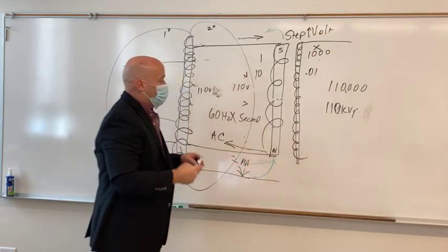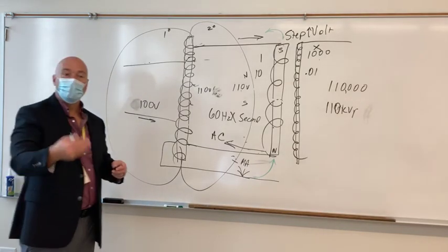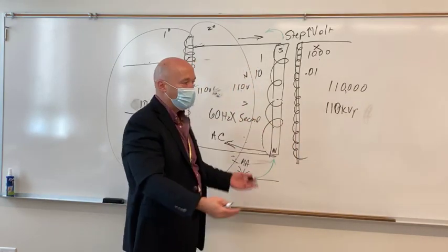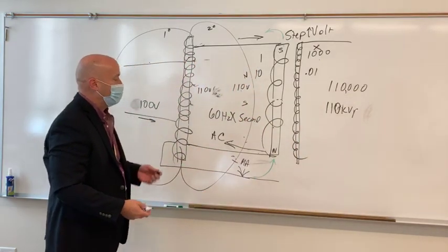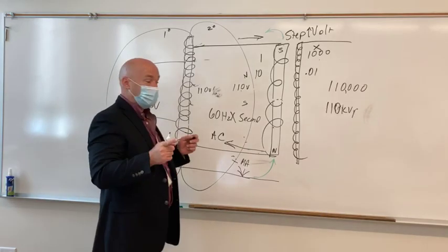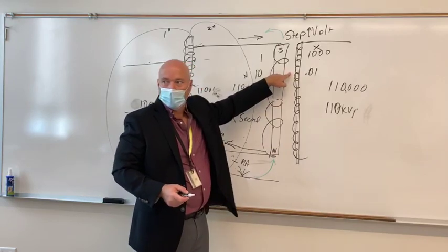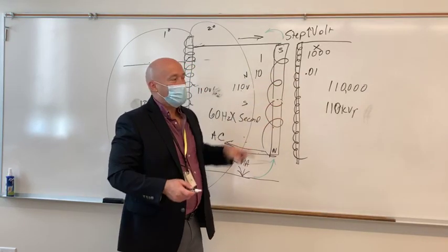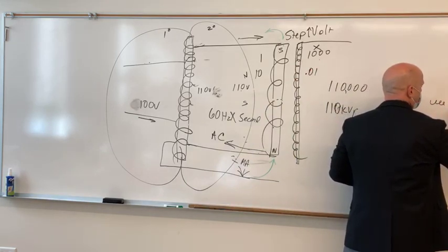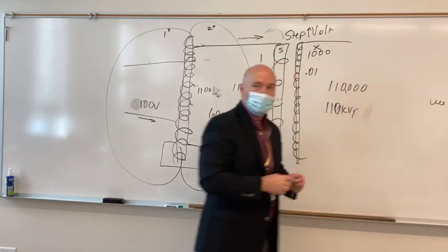What we want to do is prevent electrons from jumping across the tube too early. All right? Voltage is that force that makes the electrons go. We don't want them to go across the tube until we're ready for them to. So we don't want kilovoltage until we press our exposure button. What we need is low voltage. So if that steps up voltage, what I want before I make an exposure over here in the filament is actually maybe 15 to 25 volts, very low voltage.